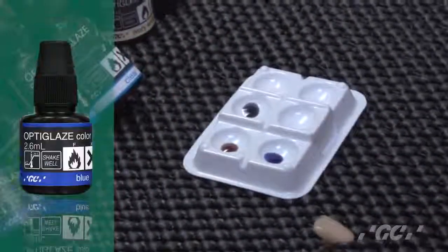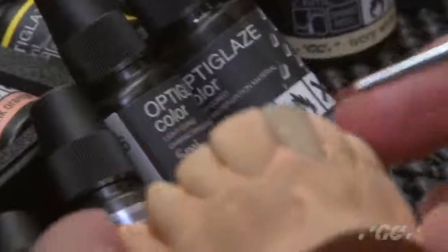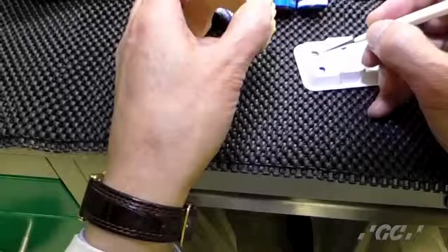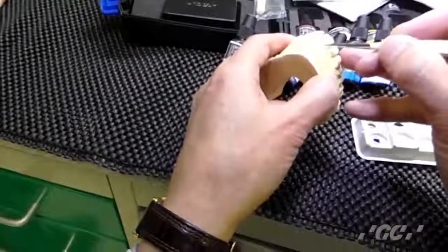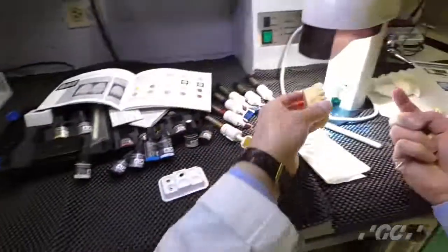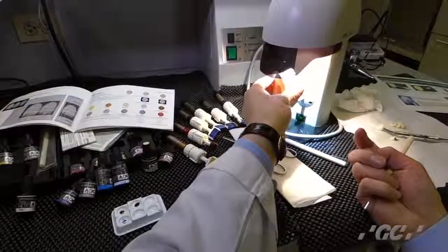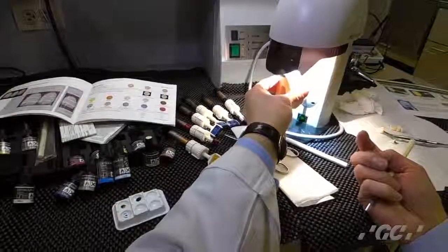Now I will do internal stains. First, if you want it a little darker here internally, this time use A shade. Just paint it on. This time is just 10 seconds — light cure it. Just temporary cure it, not completely, like half cure.